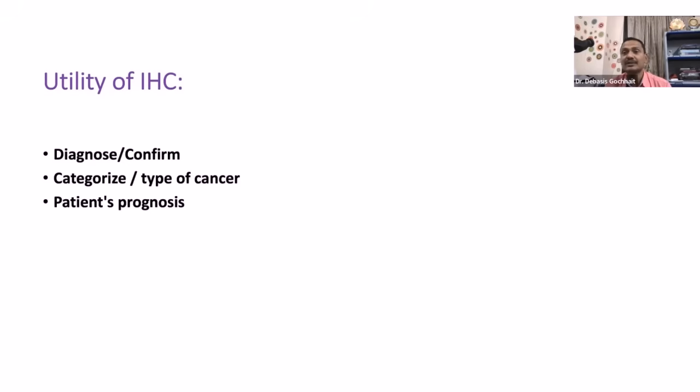In addition to that, there are also certain markers like ER, PR. Now even MBBS students will know that we do certain markers on breast biopsy, that is ER, PR, HER2/neu. Now, ER and PR, you must specifically remember, ER, PR and Ki67 are actually your prognostic markers, because your therapy depends on it. And if ER is positive, the patient will have a better prognosis.